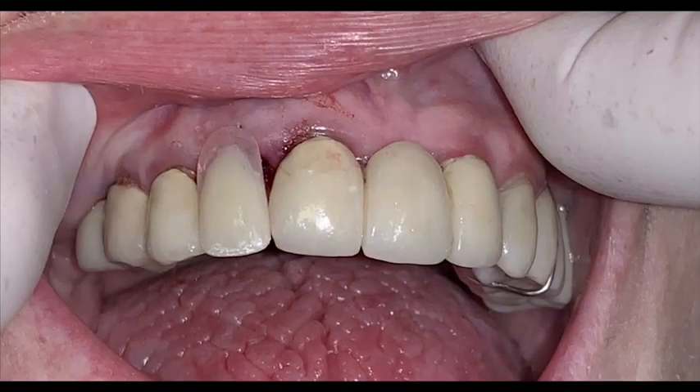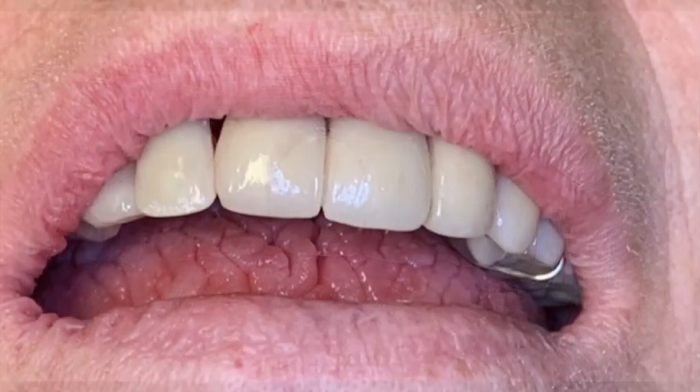On a post-surgical CBCT, note the space between the implant and the labial bone. This is crucial to get adequate bone fill so there will be a final result of at least 1.2 millimeters or more of the labial bone to help ensure long-term success of the implant. A removable acrylic partial denture was placed and trimmed accordingly so as not to put any pressure on the tissue or on the crest of the ridge.